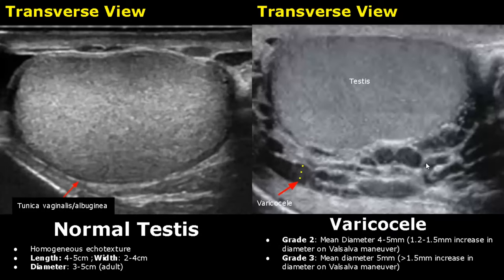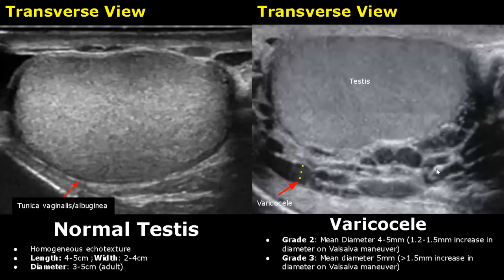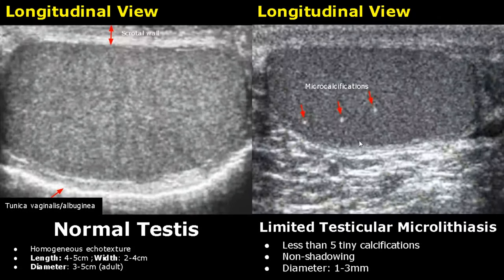In grade two varicocele the mean diameter is 4 to 5 millimeters; on Valsalva maneuver the diameter increases by 1.2 to 1.5 millimeters. In grade three varicocele the mean diameter is 5 millimeters or more, and on Valsalva maneuver the increase in diameter is greater than 1.5 millimeters.